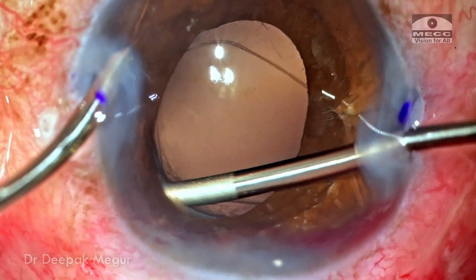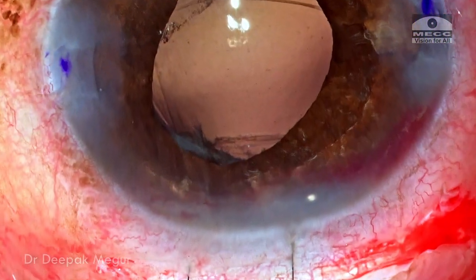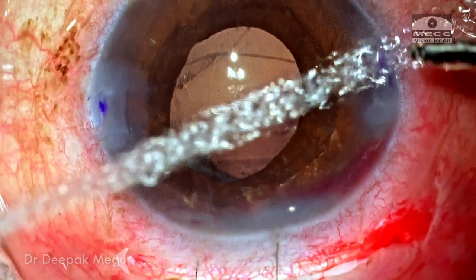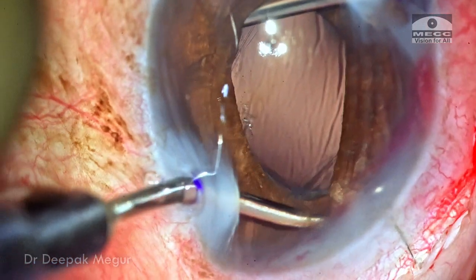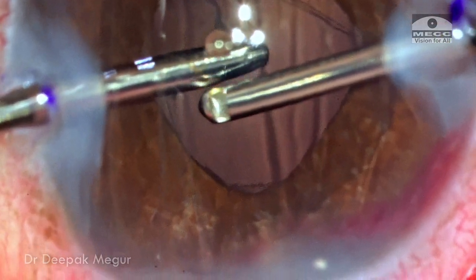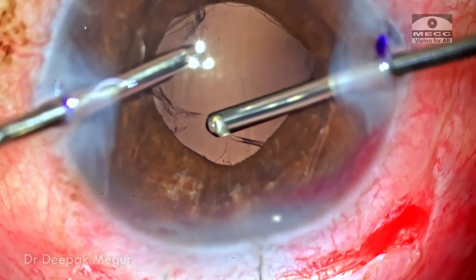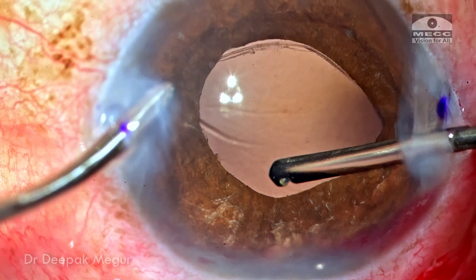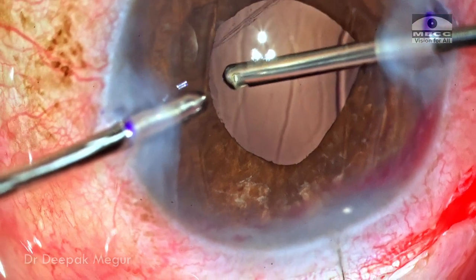The hands are switched and the cortex in the superior quadrant is aspirated in a similar way. There are a few fibers of vitreous on the anterior surface of the iris that look very sticky, so I'm changing to IA cut mode. The fibers are pushed up using the irrigating handpiece, engaged by the vitrector, cut and aspirated. During this maneuver, some of the more fragile posterior capsule comes into the port of the vitrector and gets chewed off. Nevertheless, the stronger support of the remaining posterior capsule in the inferior hemisphere is still intact and I'm hopeful I can place a PC lens.